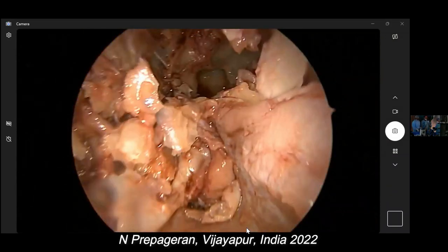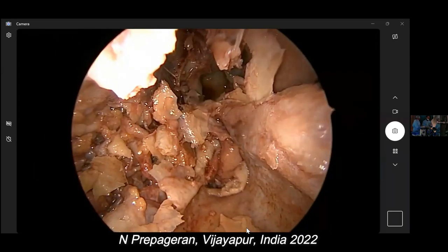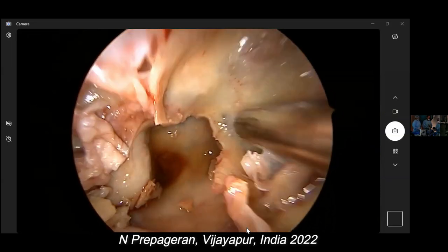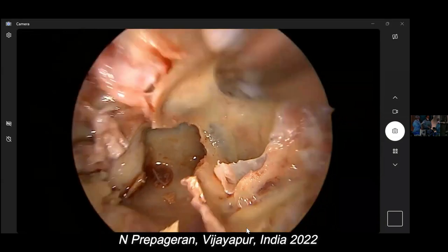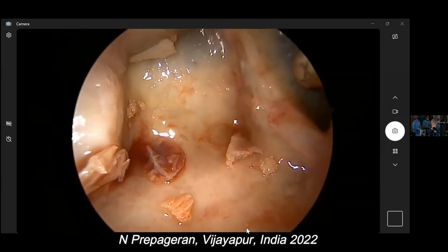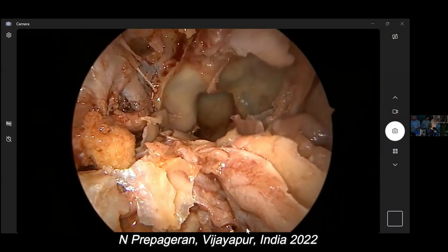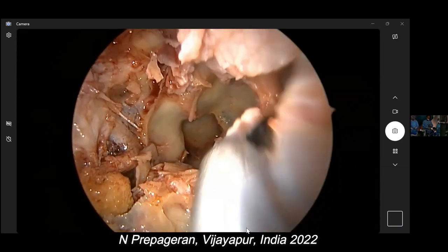Divide again. We need more space on this side. So we have an unusual sphenoid sinus, which makes the dissection a bit more complicated and difficult. Oh, we have a solid bone behind here, guys. I think we are going to have a bit of difficulty now because this bone is solid. There's no space. So what will I do in real life if I have this? I'll just drill. Let's assume I have to do a skull base approach for this guy.